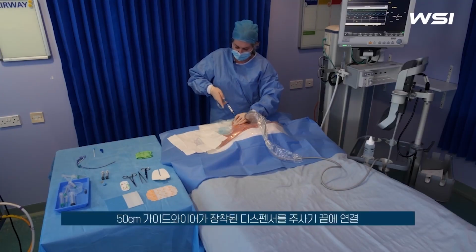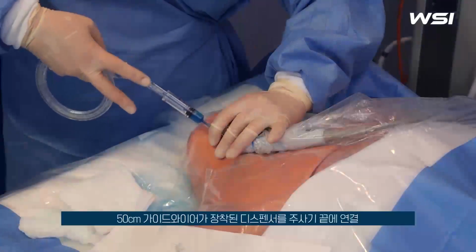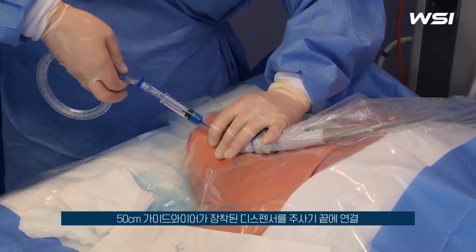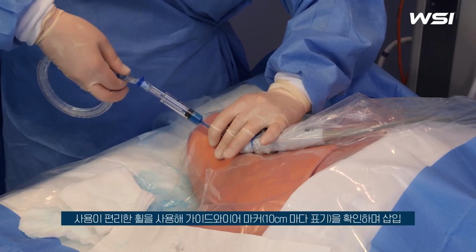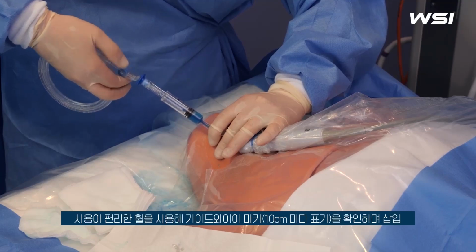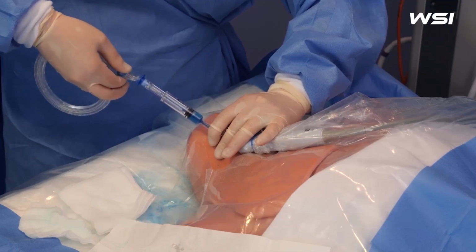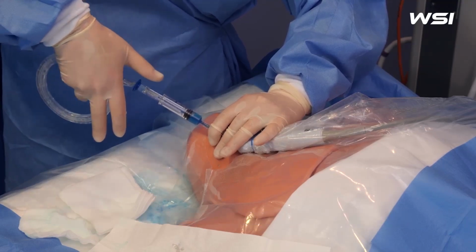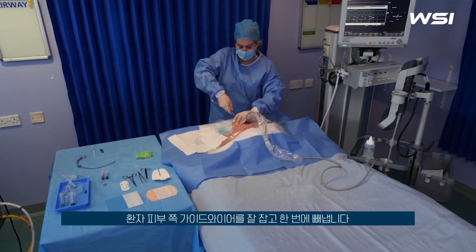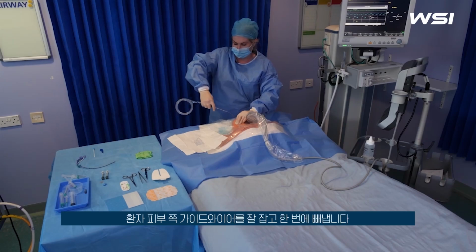What we're going to do is connect, then slowly, using the ergonomic wheel, put your guide wire in place. Use the gradations here, so I'm at 25 centimetres there. All of it can be withdrawn at once, just making sure that you grab the guide wire at the skin edge.